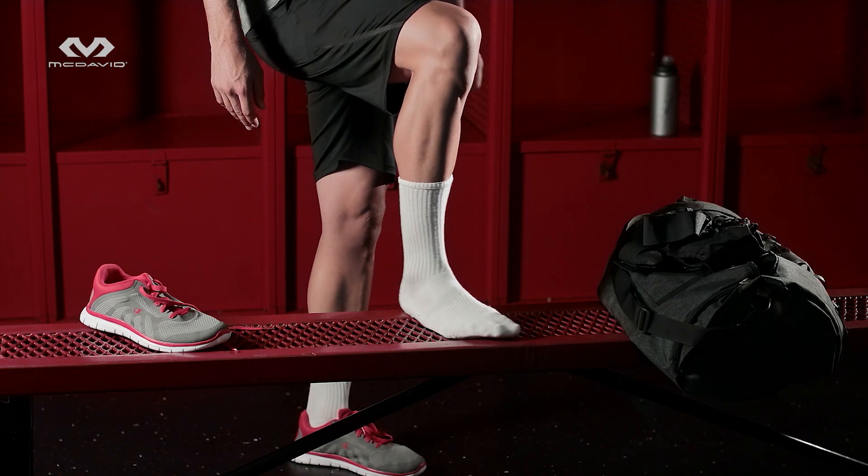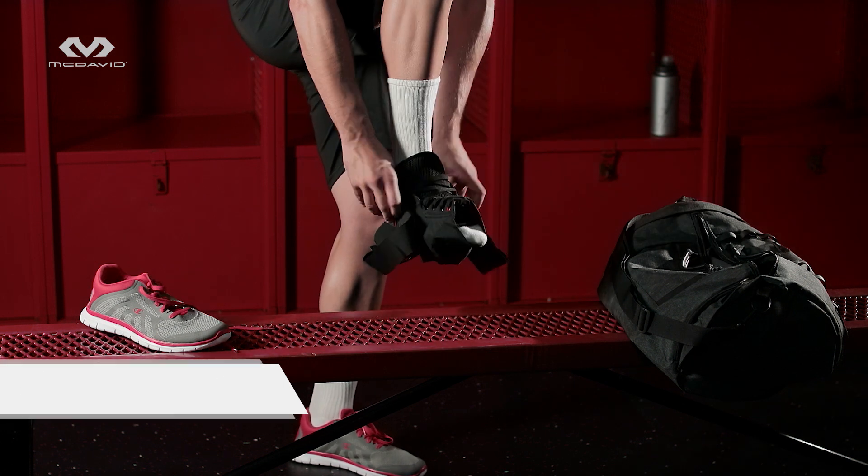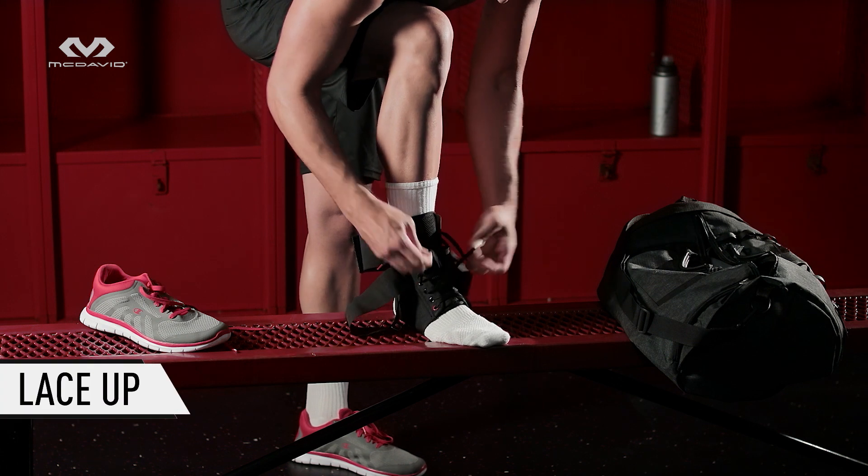Okay, let's gear up. Slip your foot into the loosely laced 195. Be sure the heel is as far back as possible. Now lace and tie the brace like you would a shoe.